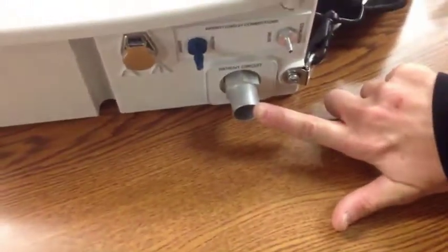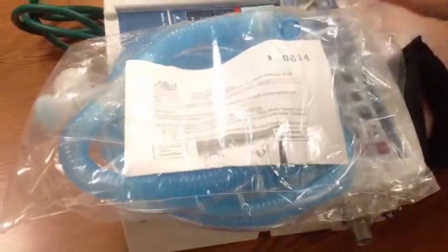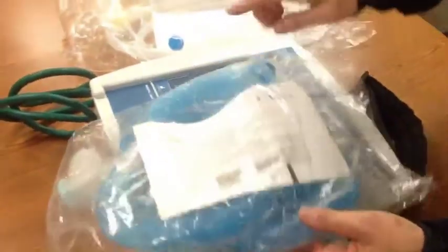For ease of demonstration, we're going to set this back down. And on the opposite side, you'll notice where the patient circuit is going to be hooked in. Now we have two different patient circuits. We have adult circuits and we have pediatric circuits. The interesting thing is that a pediatric circuit will explicitly say on its label, single patient use pediatric ventilation circuit. It has a smaller corrugated tubing in comparison to the adult corrugated tubing.